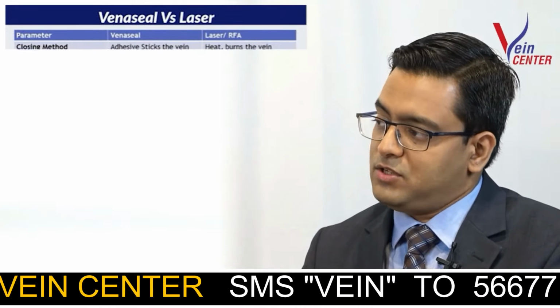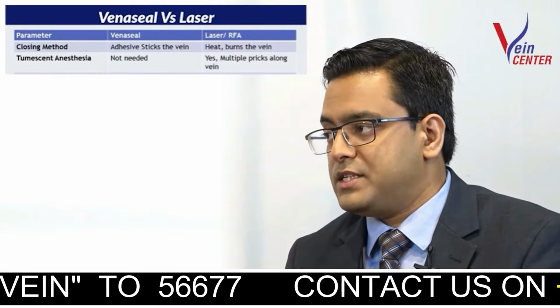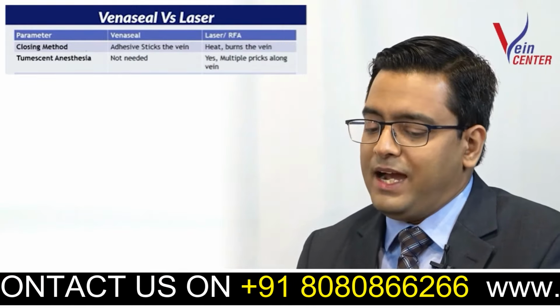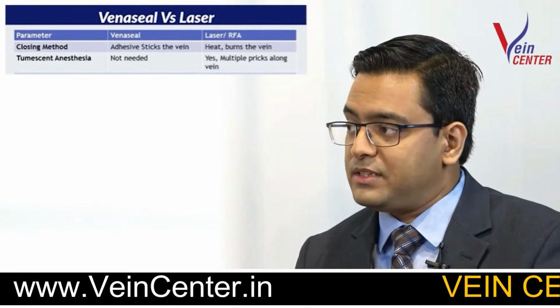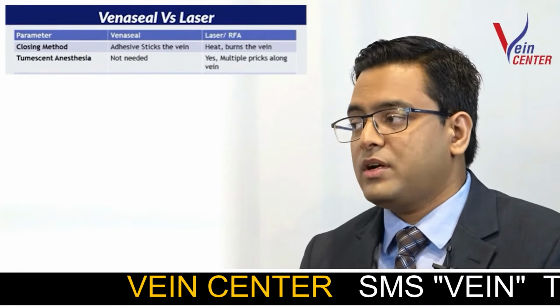Dr. Saurabh, what is the difference between VenaSeal and laser? So the primary difference between VenaSeal and laser is the closing method. The closing method with laser is heat, where we burn the veins and we close the veins by compressing them with stockings. With VenaSeal, the primary closing method is the glue which we inject. This is an adhesive which we inject inside the veins, and when we press it, it seals from the inside. Other than that, there is the requirement for local anesthesia, which is also called tumescent anesthesia. In laser, the tumescent anesthesia is compulsory, where we have to give multiple pricks and give a lot of fluid inside, and in VenaSeal we do not need any of that.